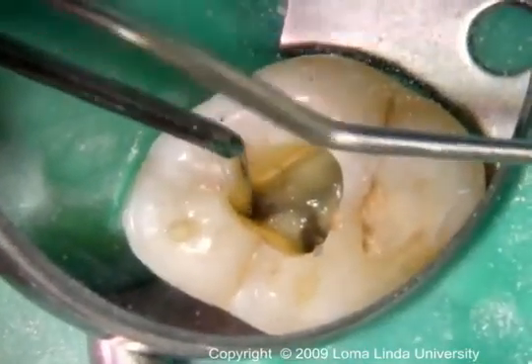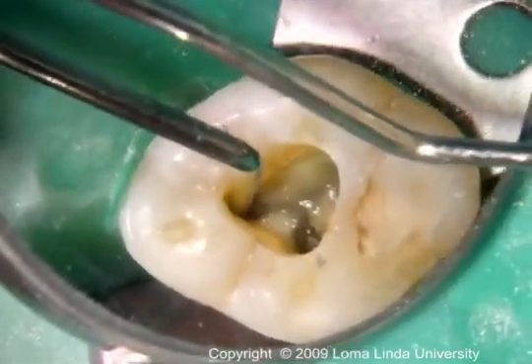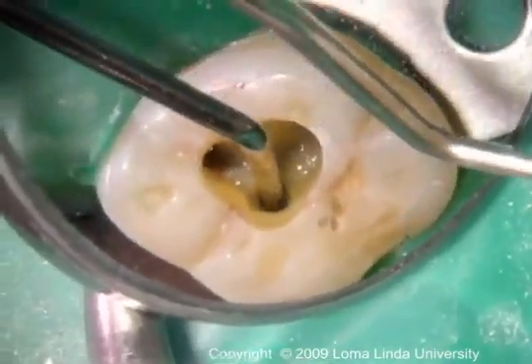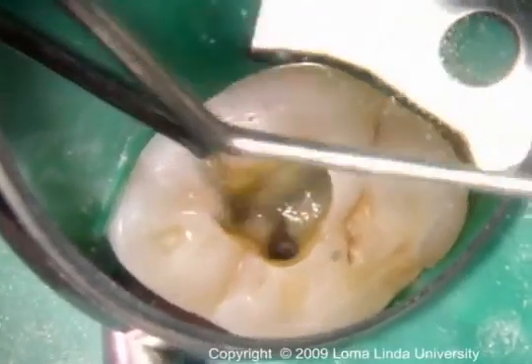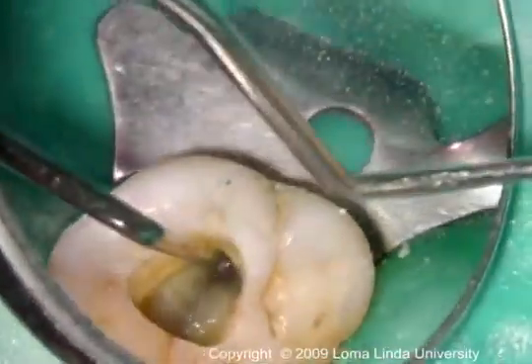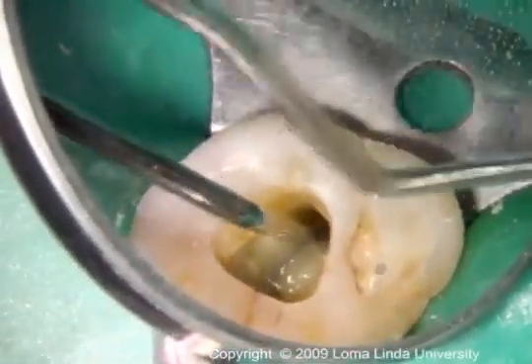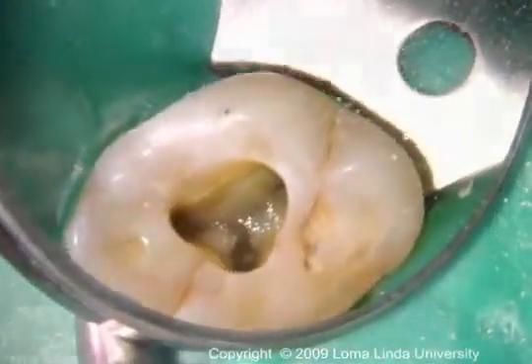The mesiobuccal canal orifice is located under the mesiobuccal cusp tip. The distalbuccal canal orifice is found under the distal cusp and slightly lingual to the main mesiobuccal canal. The palatal canal orifice usually lies under the mesiolingual cusp tip.